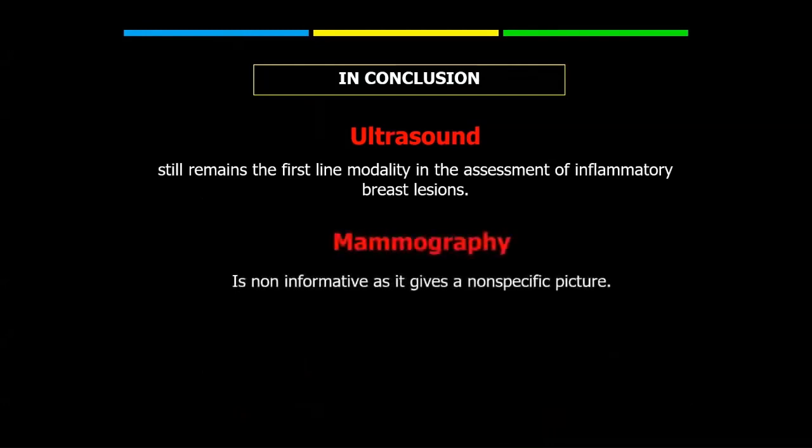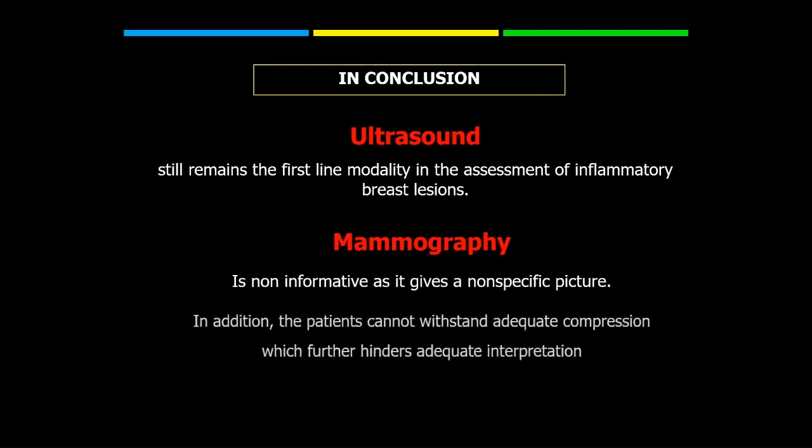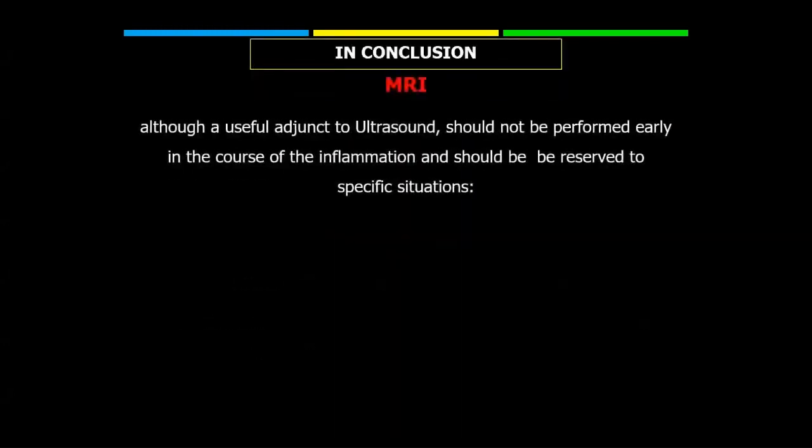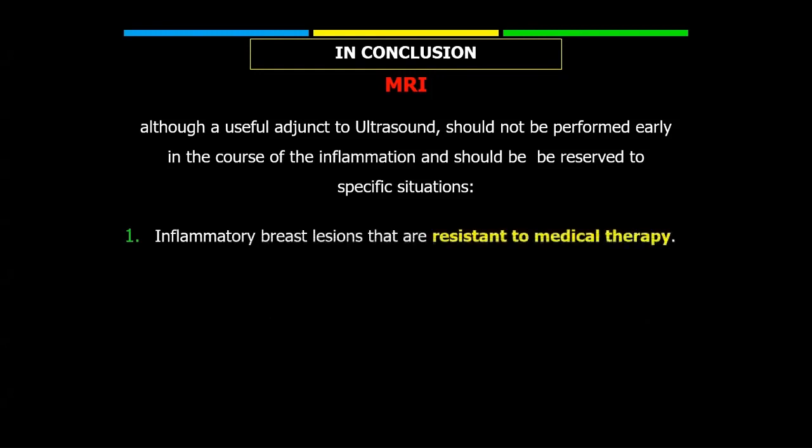Mammography is non-informative as it gives a non-specific picture. In addition, the patients can't withstand adequate compression, which further hinders adequate interpretation. MRI, although a useful adjunct to ultrasound, should not be performed early in the course of inflammation and should be only reserved for specific situations.